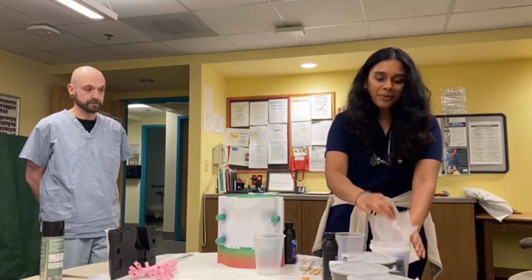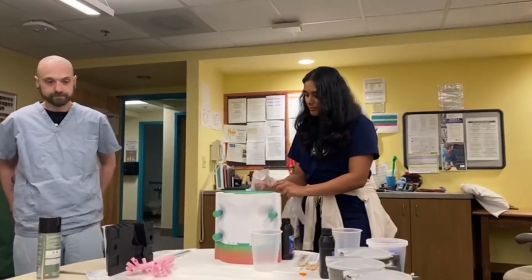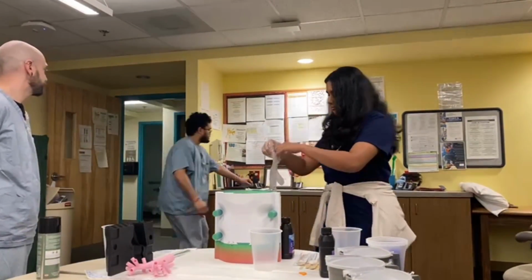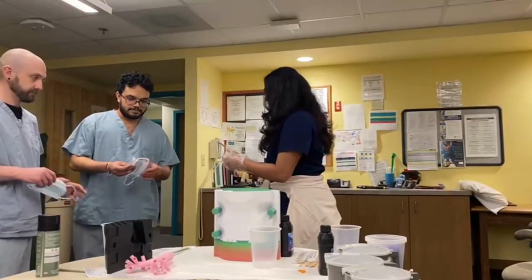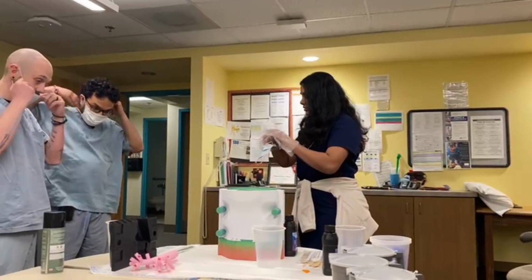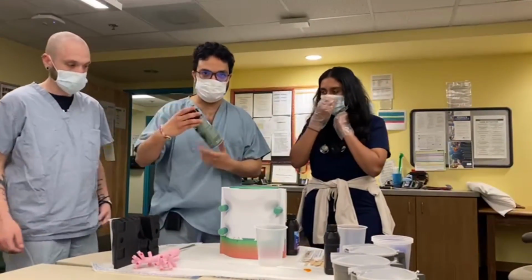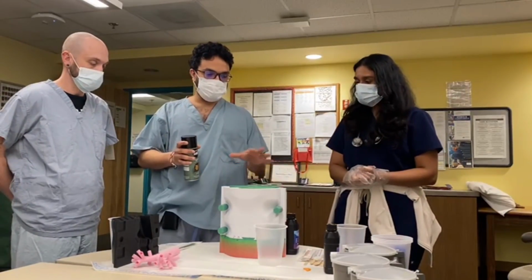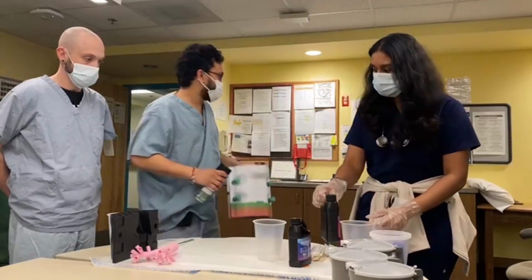For that though, I'm going to put on some gloves and a mask. As they start mixing, I'm going to put the releasant. This is a silicone releasant that's going to help make sure the mold doesn't stick. While they mix the proportions, I'm going to come right back.